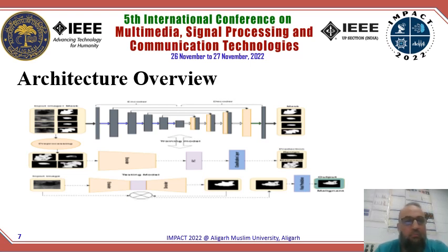Here at the end is the test system. Suppose we put it in the hospital, the doctor just inserts the image and our system will automatically detect the tumor, as shown here in the segmented part. After that, we define whether the tumor is benign or malignant.